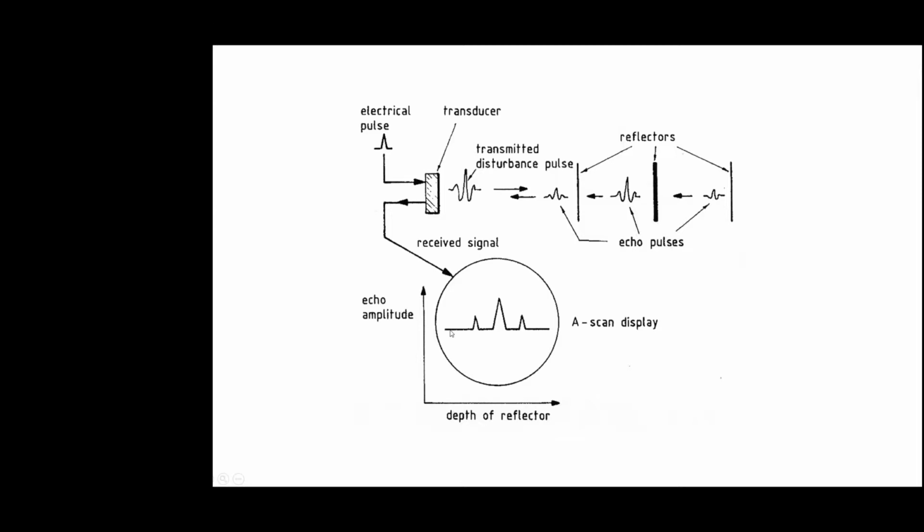So this gives us a line representing what is in the tissue inside of that line, right? If we represented this with intensity values on a screen, this would be kind of gray. This one here would be a white, thick spot, and this would be another gray spot, and the bottom line would be a black region. So that creates a line.